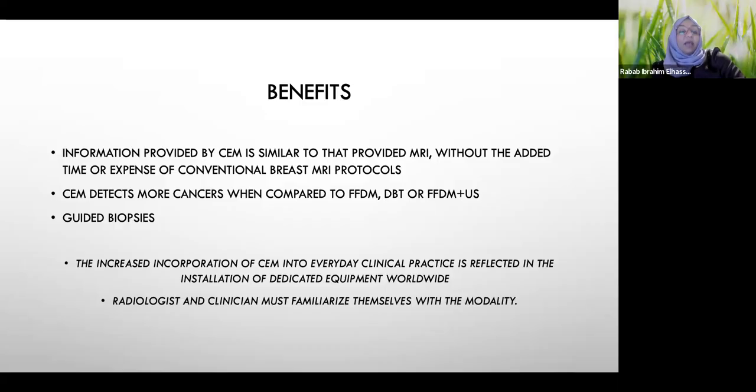And the other advantage is that it can guide biopsies. This is very important because for now, if we have a lesion that is not visible on mammogram, and not visible on ultrasound, but only, for example, in the MRI, our only way of biopsying that lesion is to do MRI guided biopsy, and this is a very difficult technique, not available even in the UK except in very few centers. But contrast enhanced mammography provides us with another way to biopsy these lesions.